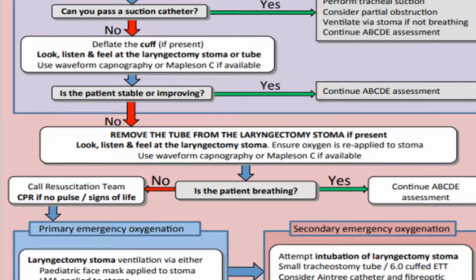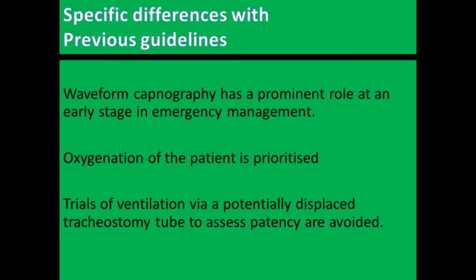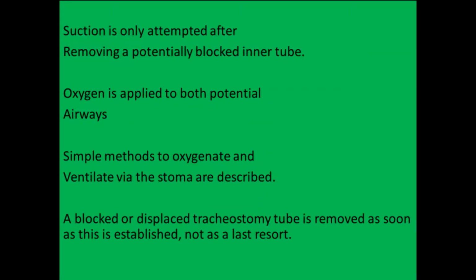The specific differences with previous guidelines include the prominent early role of waveform capnography, oxygenation being prioritized, and avoiding trials of ventilation via a potentially displaced tube. Suction is only attempted after removing a potentially blocked inner tube.